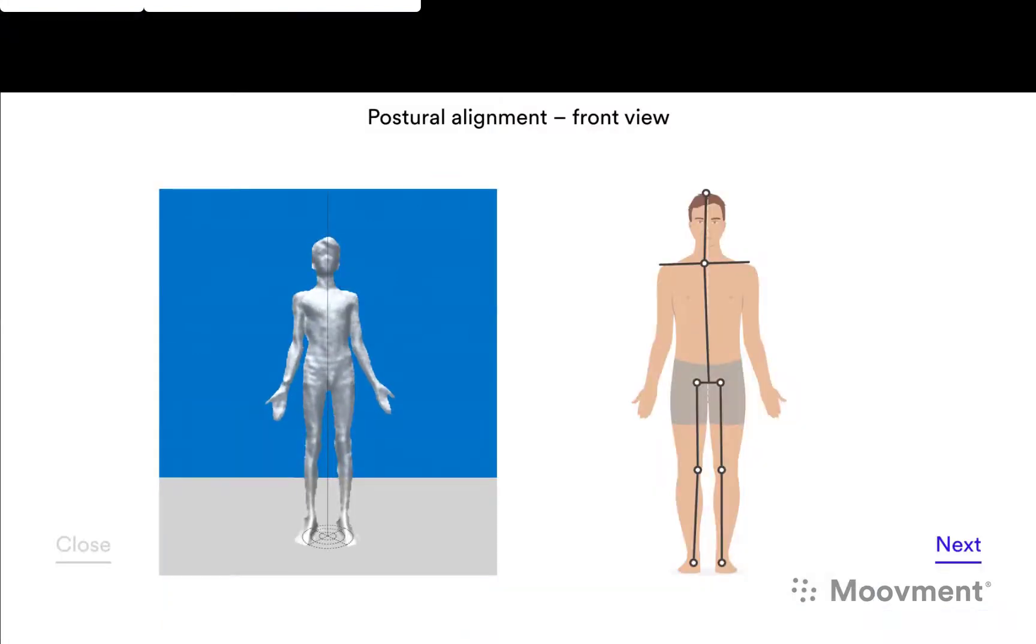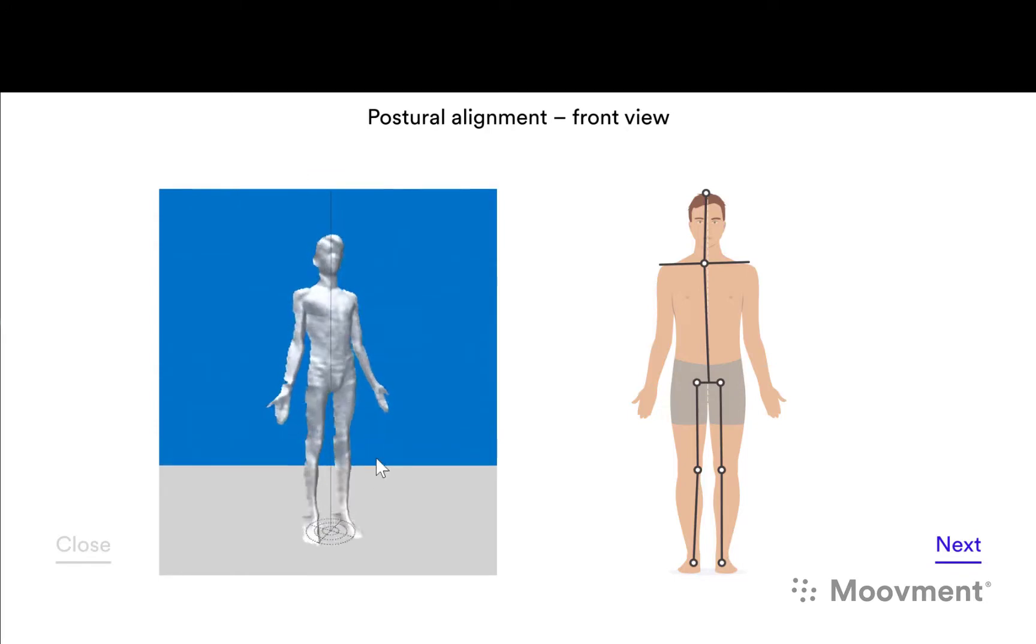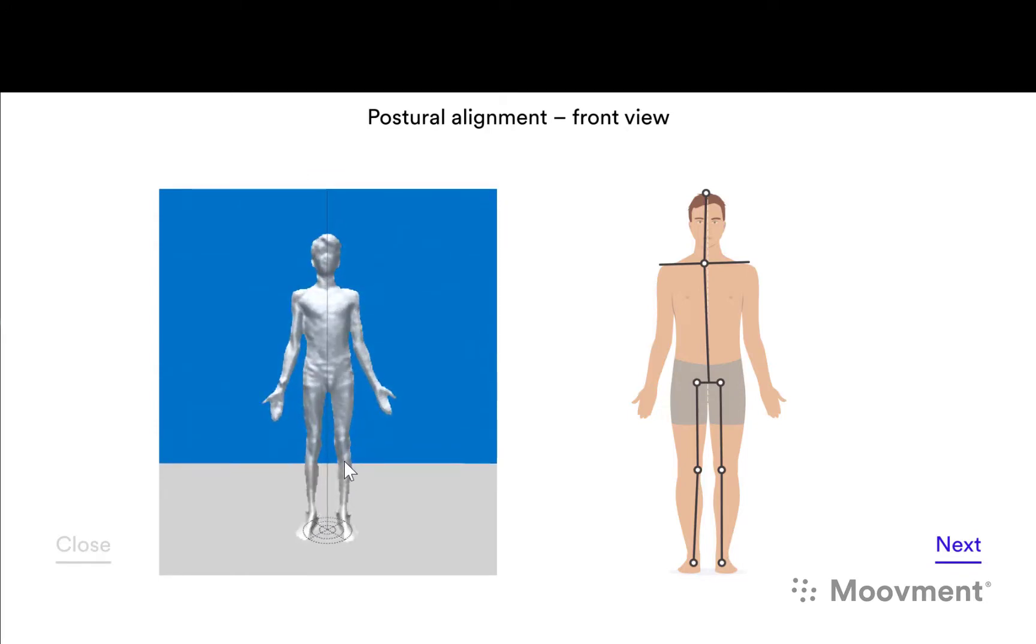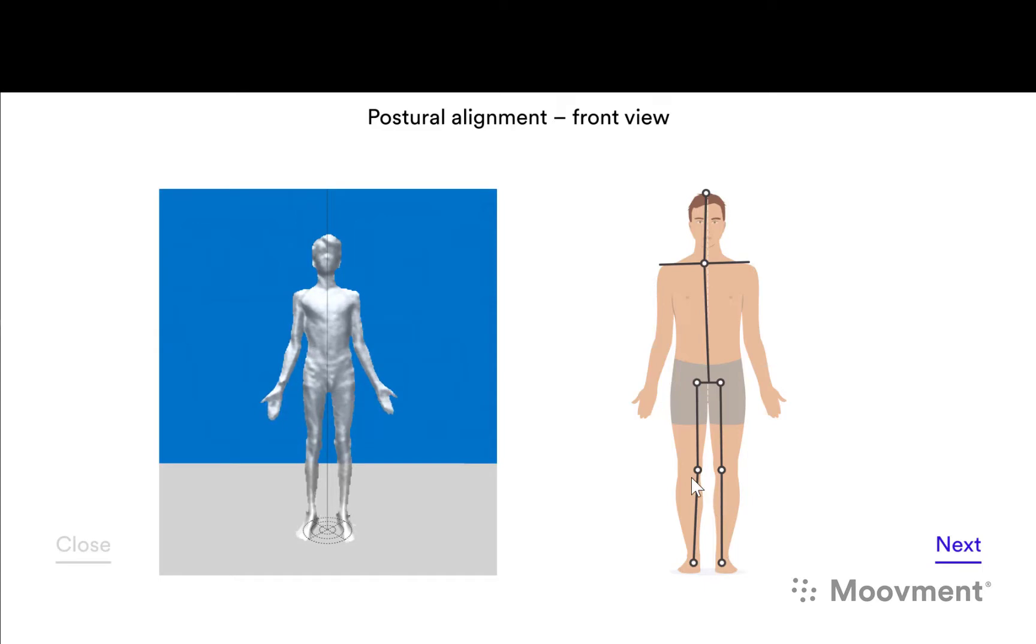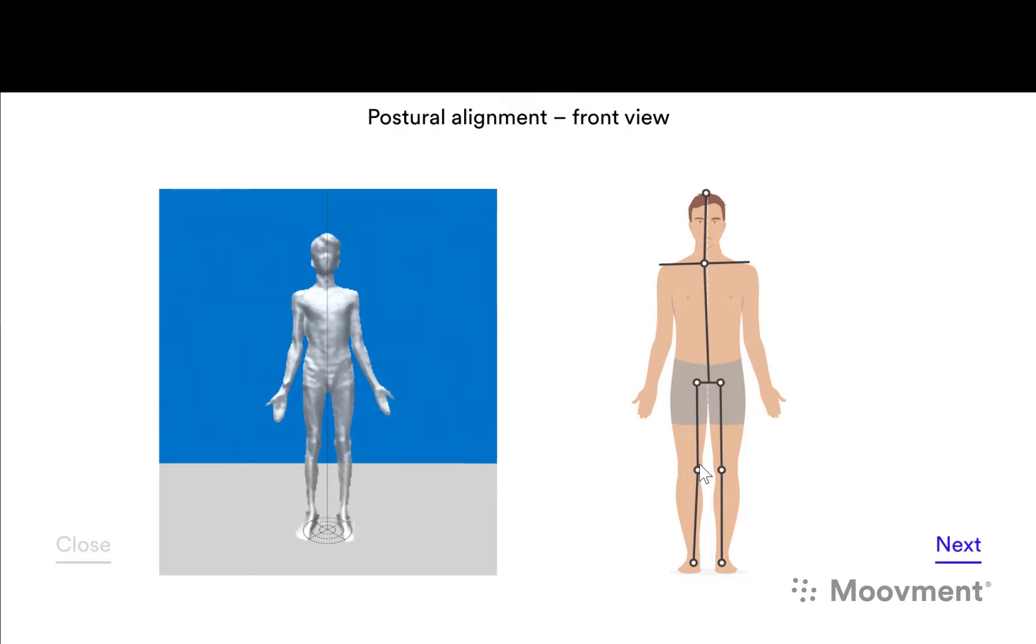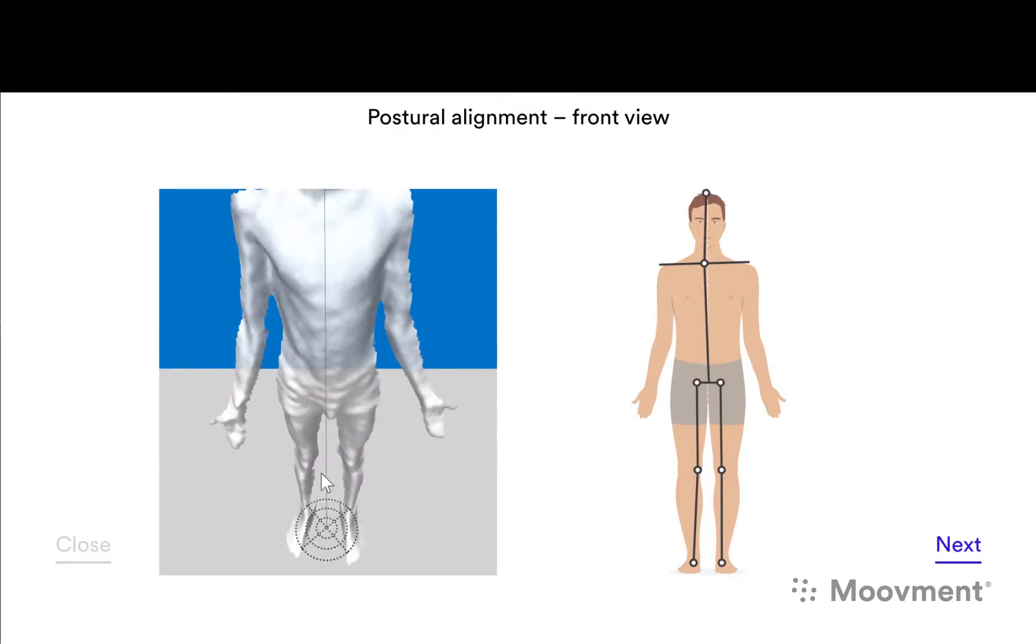When we bring in the feedback screen it's possible to move the person in 3D and use this to communicate to the client. You can see some basic stick figures that show that this right knee is internally rotated with a slight apparent valgus, but it's actually an internal rotation of the hip which becomes quite apparent when you zoom in here.